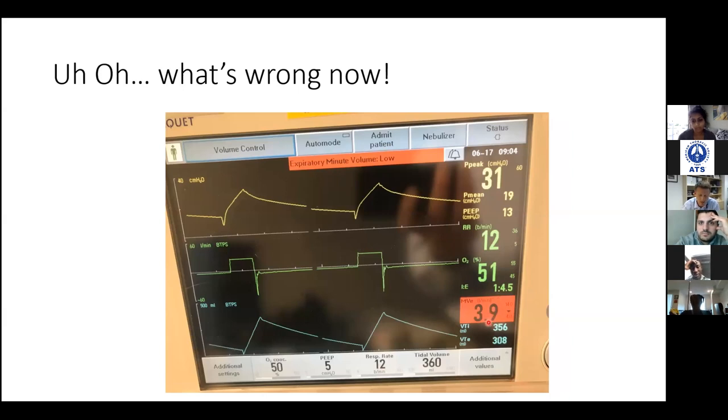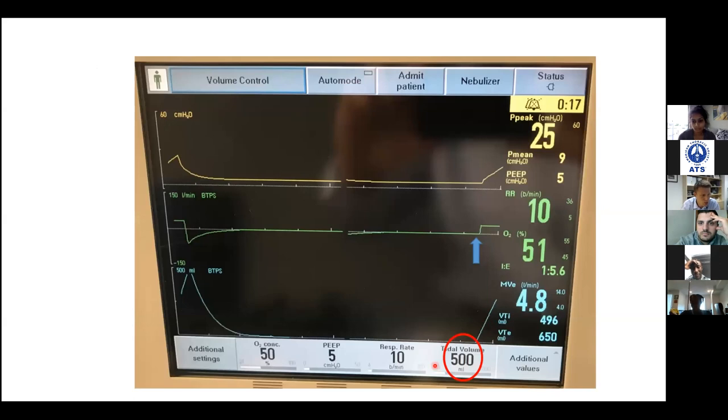Patient could be acidotic. You're right. And so this is the one situation in which increasing your tidal volume, maybe even above 8 cc's per kilo, is acceptable. The one situation, okay? Because you have to maintain a minute ventilation high enough that you can breathe off CO2 so the patient doesn't become overly acidemic. And that's the story of asthma.